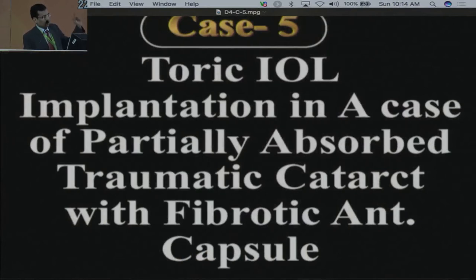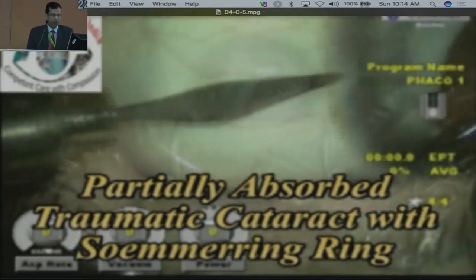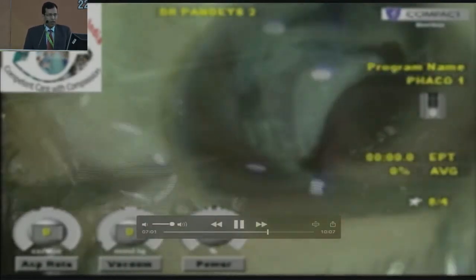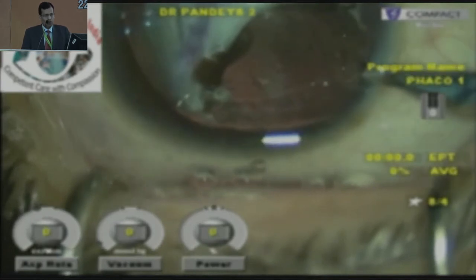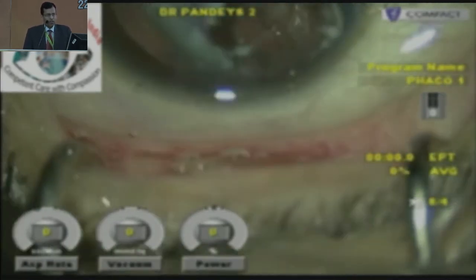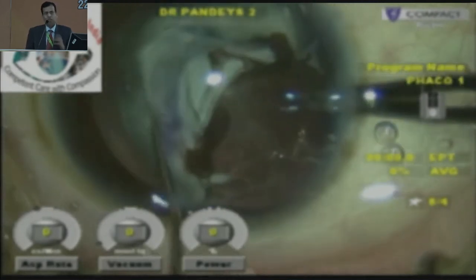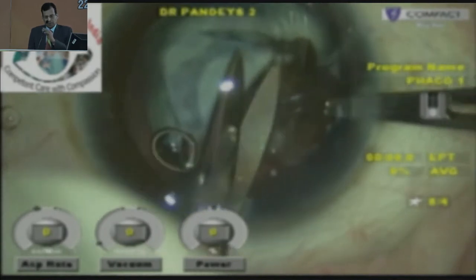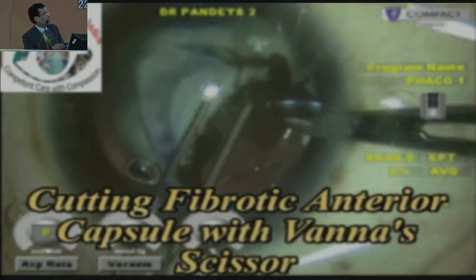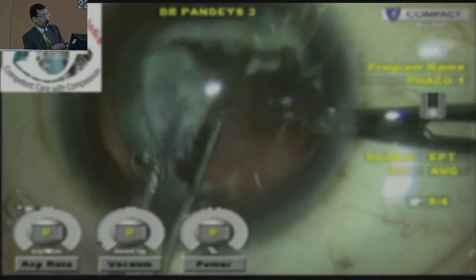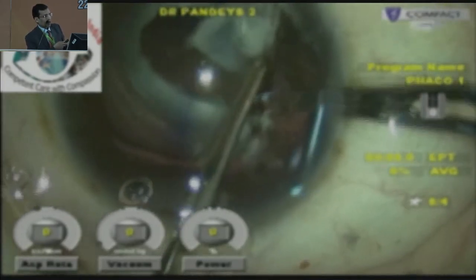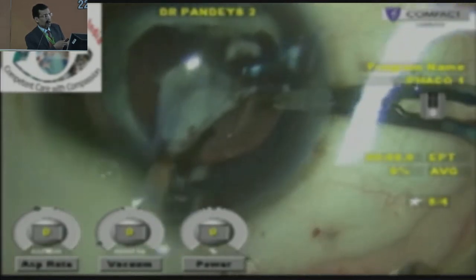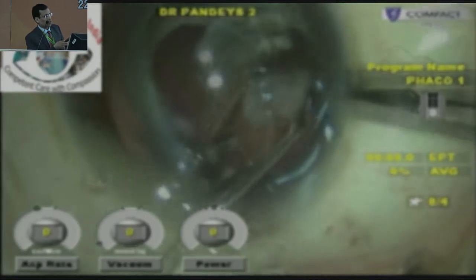This is perhaps my second-to-last case, where I implanted a TORIC lens in a case of partially absorbed traumatic cataract. This was done a couple of years ago — a young child, 16 years old, with a long history of trauma. In such cases, it's very important to perform precise investigations. I did a B-scan and the posterior capsule was intact. There was fibrosis of the capsular bag. I used the Vanass scissors to cut the anterior capsule.